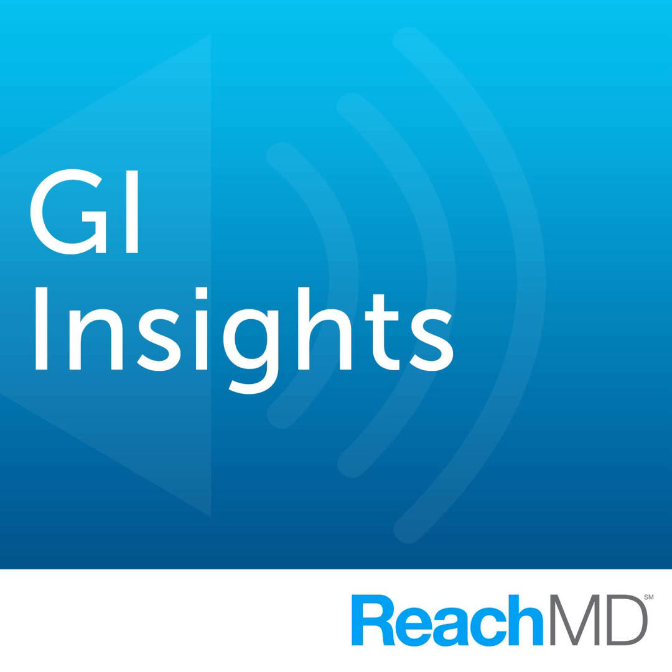And at the present time, we have 3 main means of performing deep enteroscopy. 2 are balloon-assisted. One is called the double balloon enteroscope by Fujinon, and then there's a single balloon enteroscope made by Olympus. And there's also a spiral overtube, which can fit over various scopes, but all 3 of these techniques allow for what we know as deep enteroscopy, meaning we can essentially assess the majority of the small bowel.